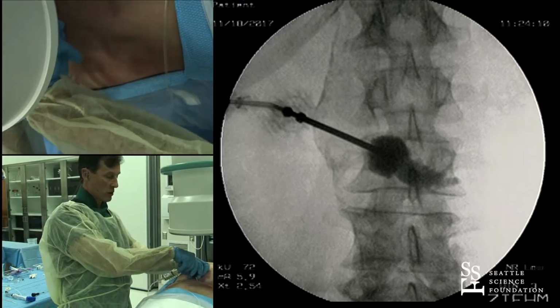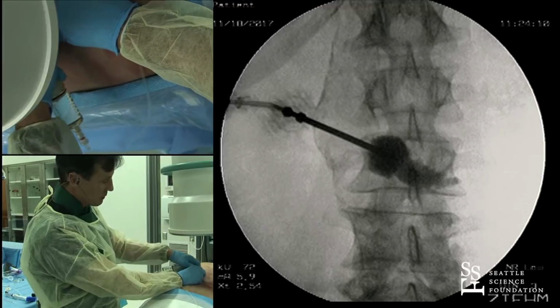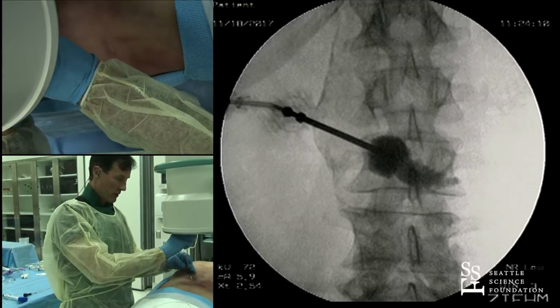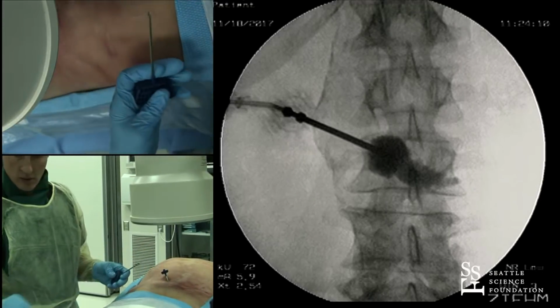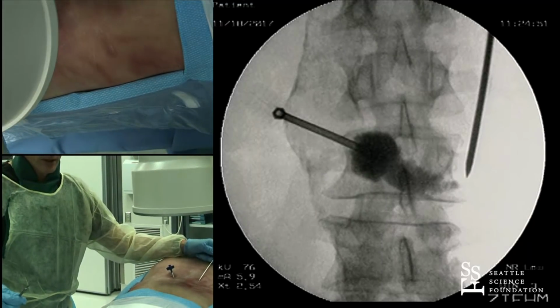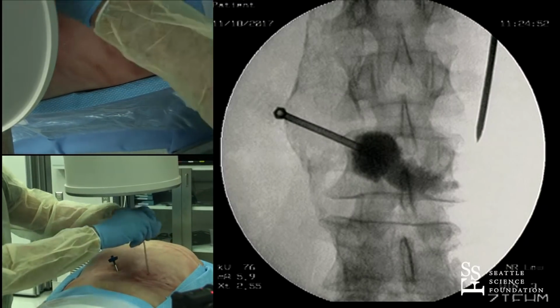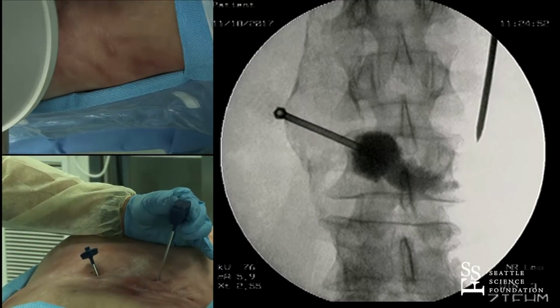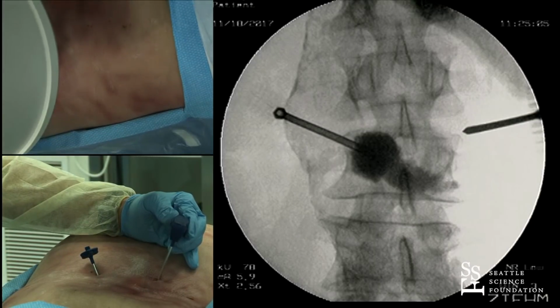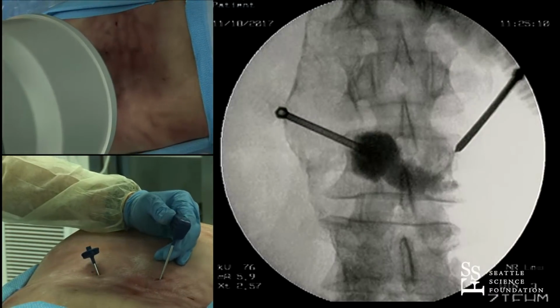Absolutely. So here, we're out of cement, and I won't do this because of the demonstration, but ideally what we do is we access the other side. So you just come over and commonly what I do is I'll do this, and then if I need cement on the other side, I do a quick access on the other side and just add more cement. So we'll show you. This is a transpedicular approach on the other side at the 2 o'clock position. It's kind of the polar mirror image of the approach that I just performed.